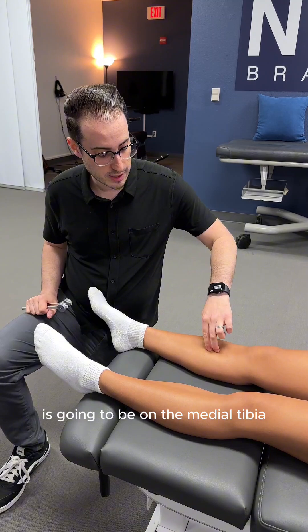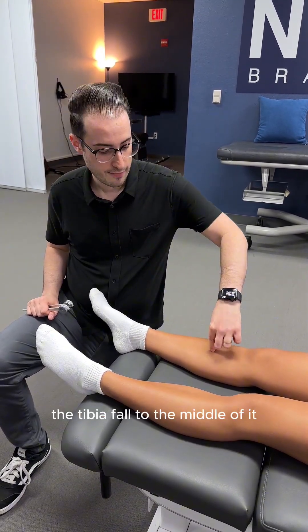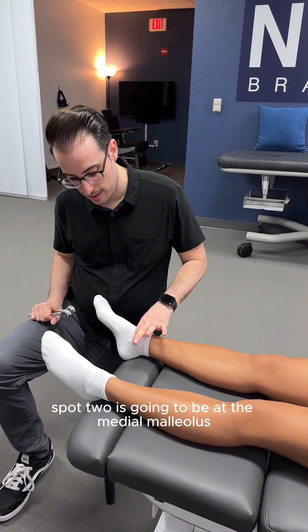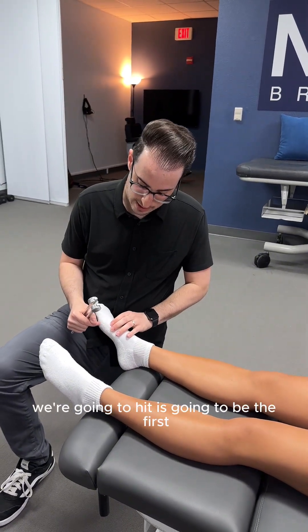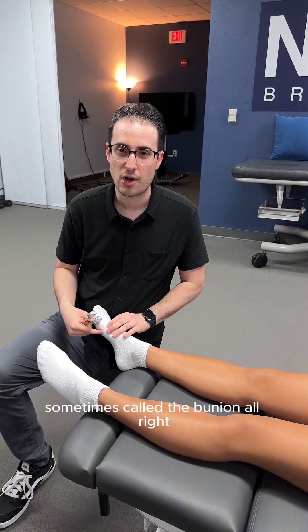The first spot we're going to hit is on the medial tibia — find this big bone in the front, the tibia, and fall to the middle of it. That's spot one. Spot two is the medial malleolus, this bump on the middle side of the ankle. The third spot is the first MTP joint, or metatarsophalangeal joint, where the big toe meets the foot — sometimes called the bunion.